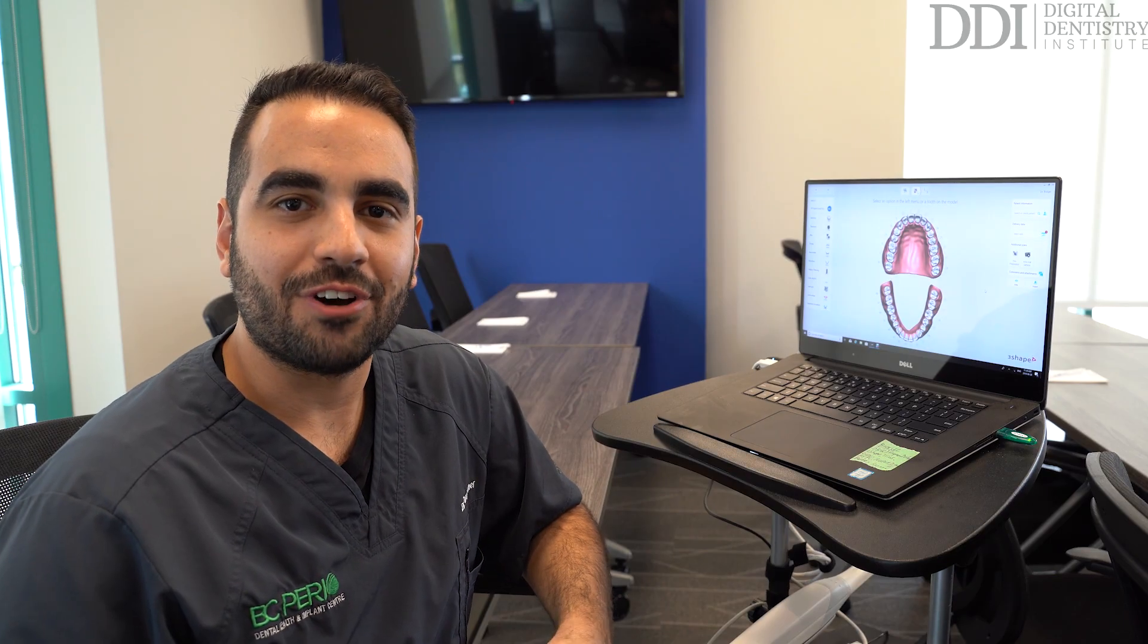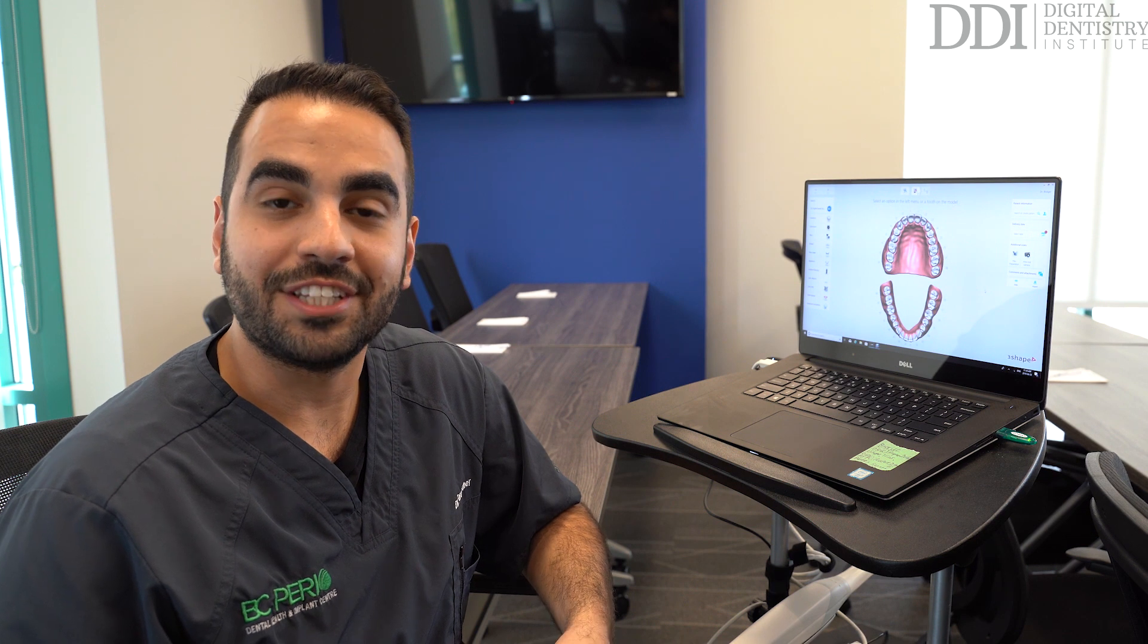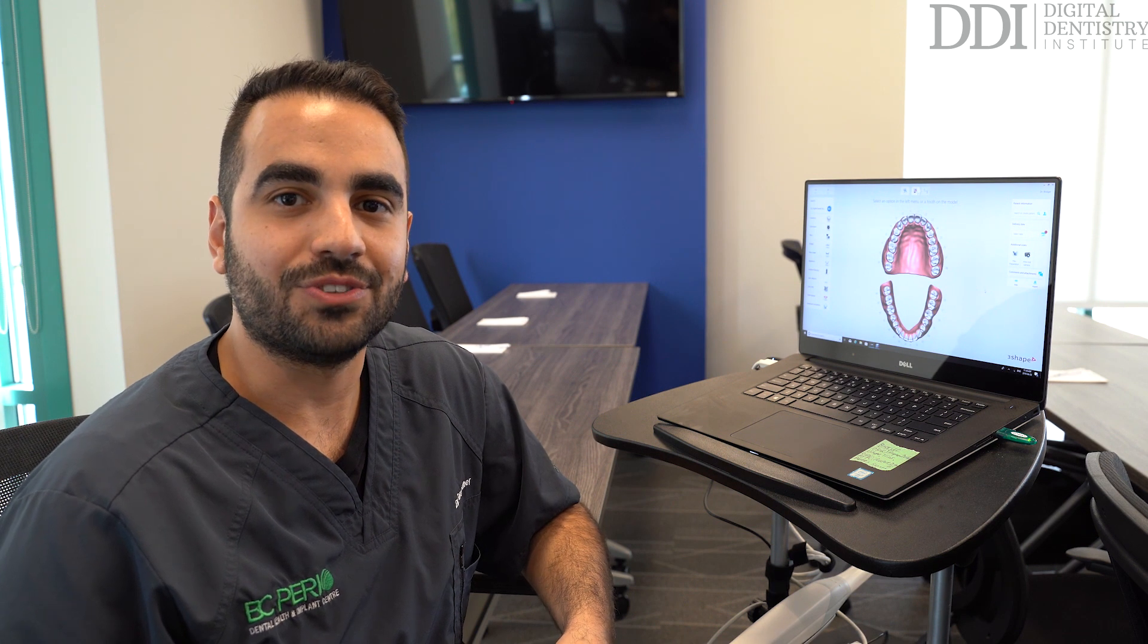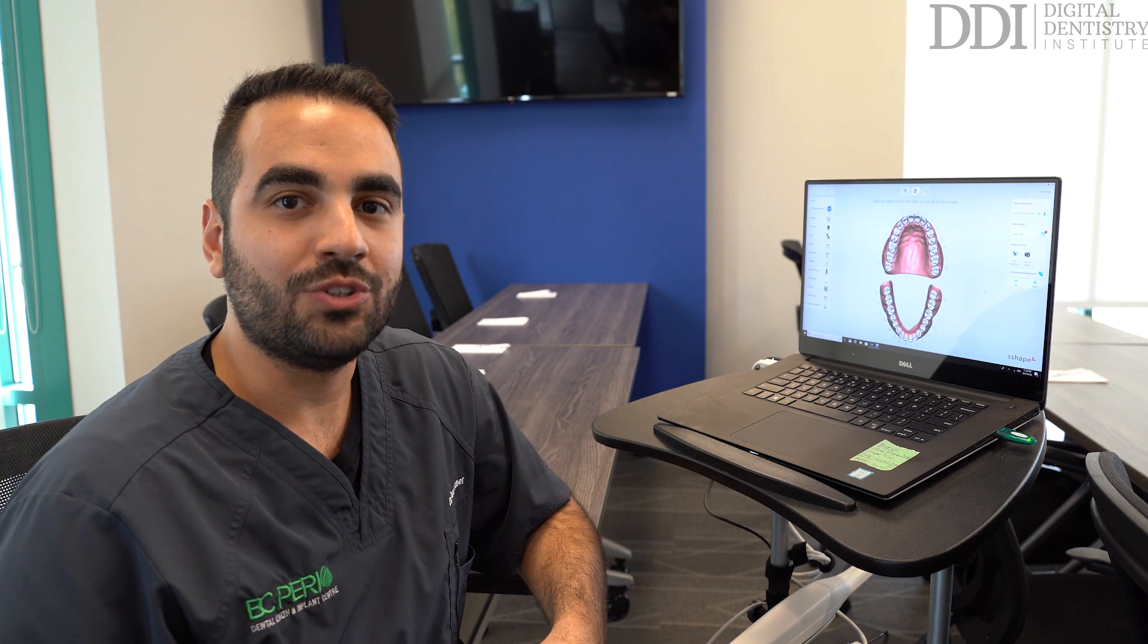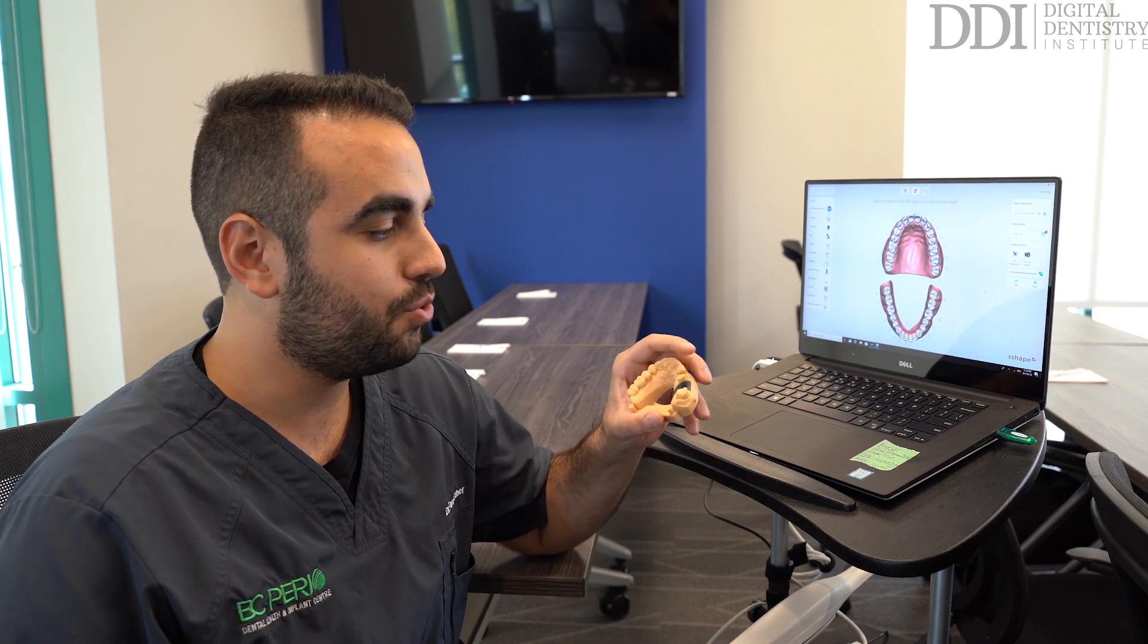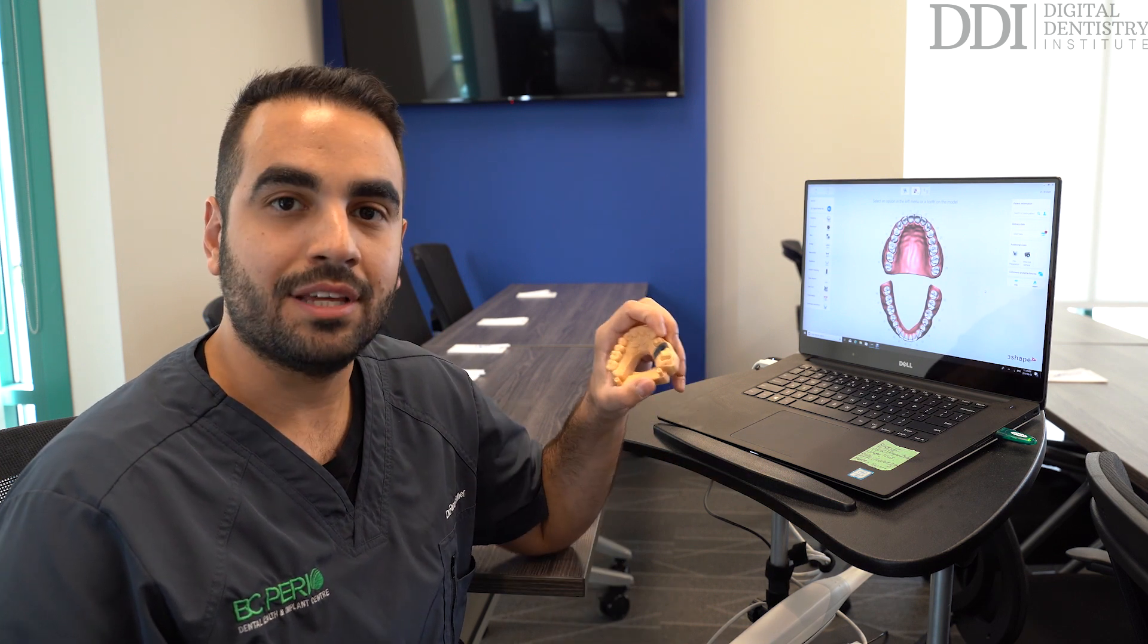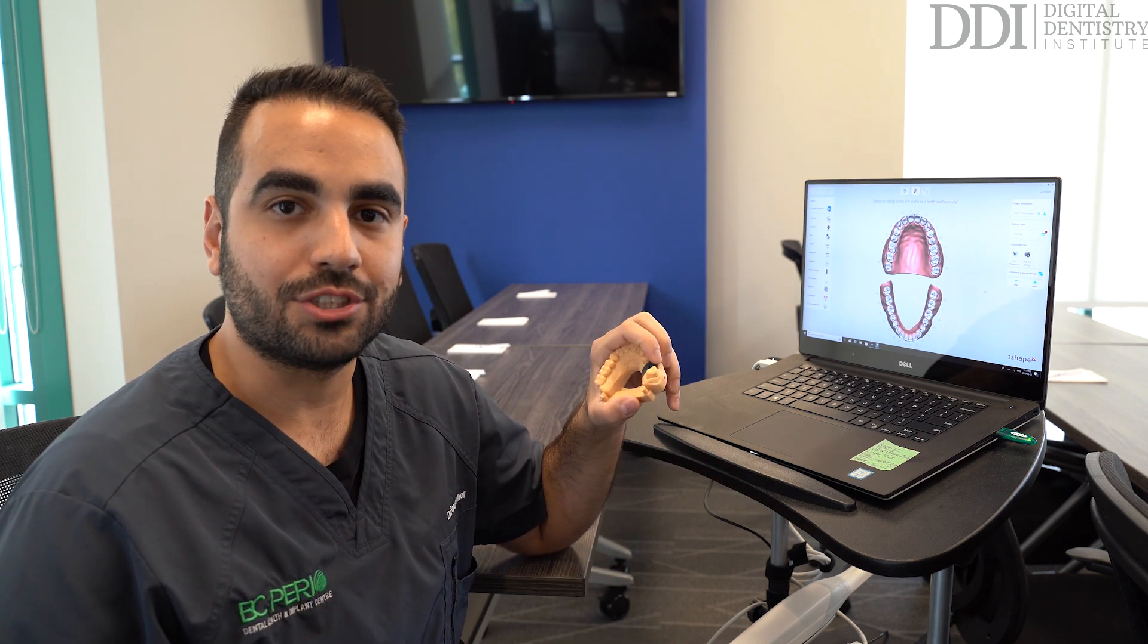Hello, my name is Dr. Faraj Edhar and I'm a prosthodontist with the Digital Dentistry Institute. Today I'm going to be showing you how we can utilize the TRIOS intraoral scanner to take both tooth-based impressions and implant-based impressions.